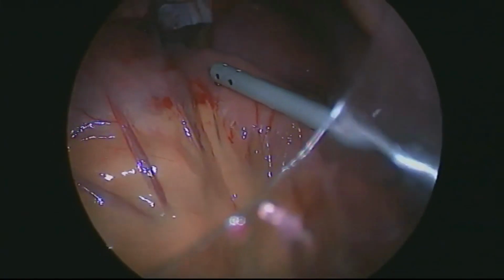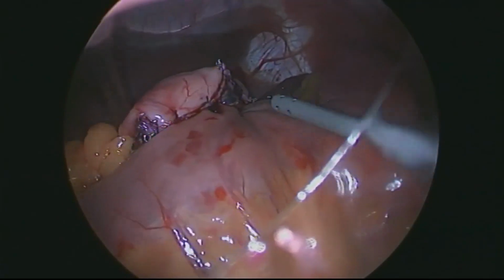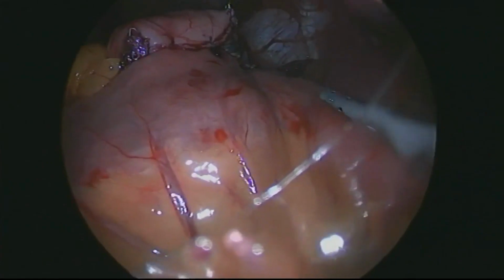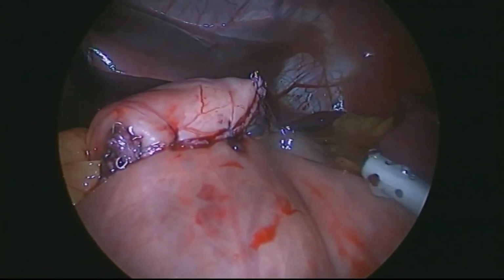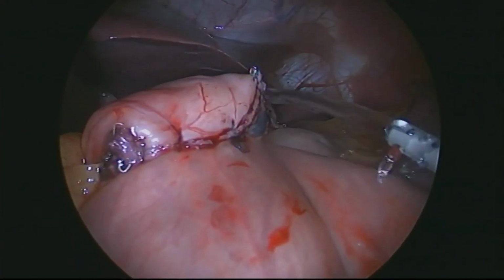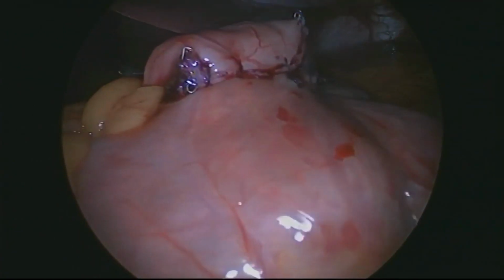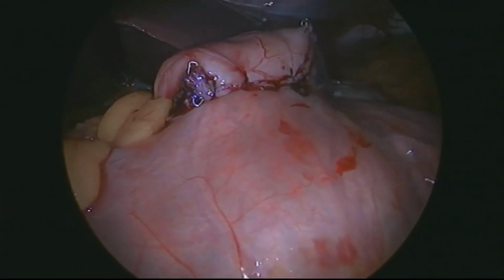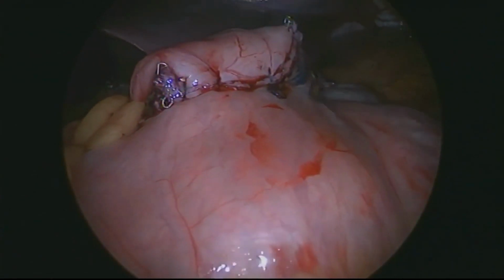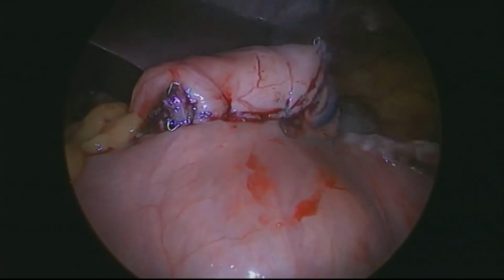So we will immerse the operative field in saline solution. The anesthesiologist will advance a large bore orogastric tube towards the anastomosis and will inject air to make sure that there's no leak, so there's no bubbles that will appear, but also to make sure that both limbs of the OAGB will actually fill up with air, which proves that there's no obstruction.